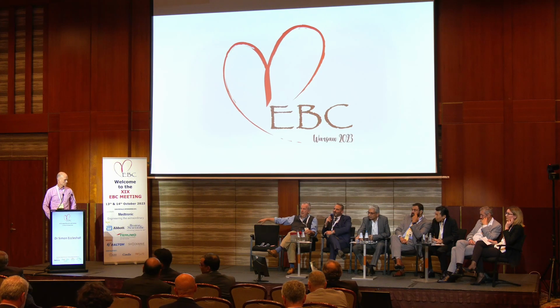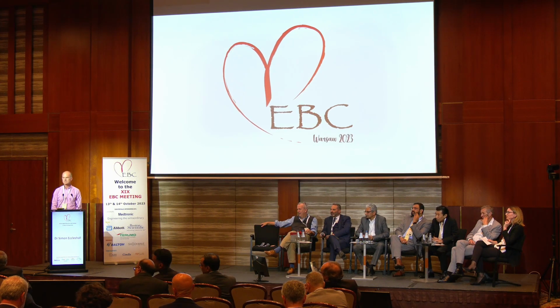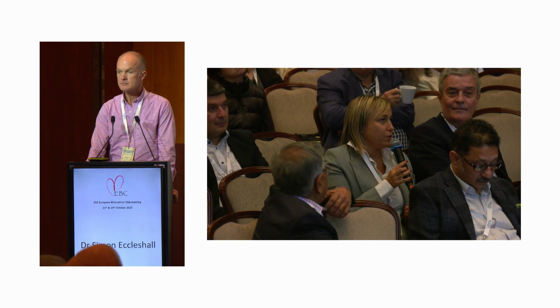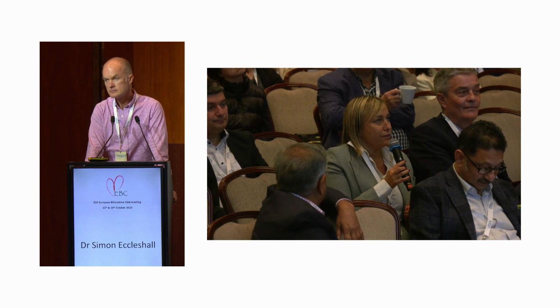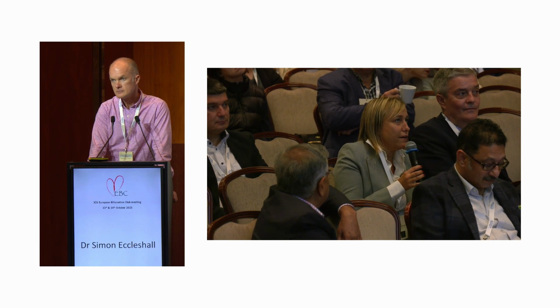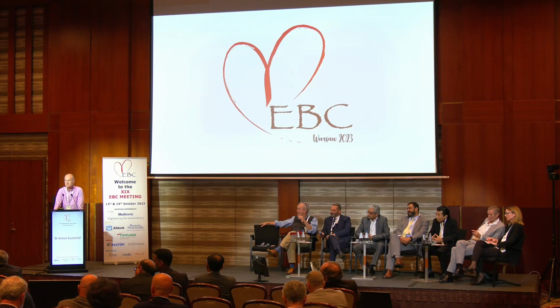Very last one, Adelaide. Okay, so mine is a question just to try to understand the mentality. Why could you not stent? I mean, stent was invented because of dissection and abrupt closure. So your point is, without having a randomized clinical trial demonstrating it's safe, what is the issue of stenting a left main toward LAD? We have more than 100,000 patients treated and they're fine. So why do you think that you don't have to stent a dissected ostial left anterior descending artery and left main? What is the rationale? Because I'm missing the rationale.